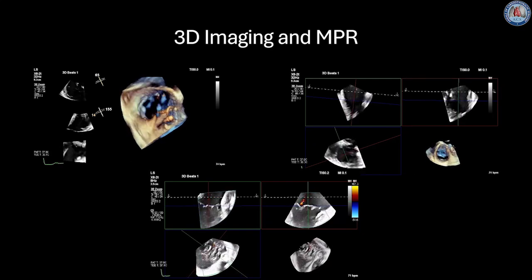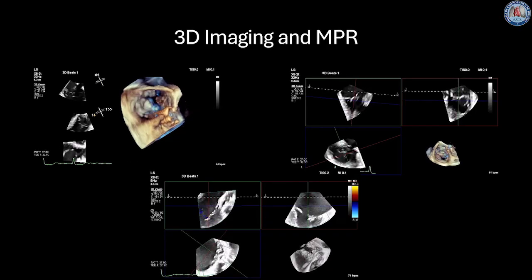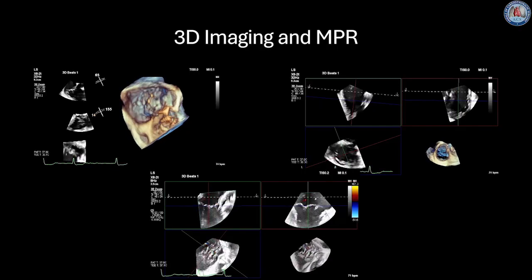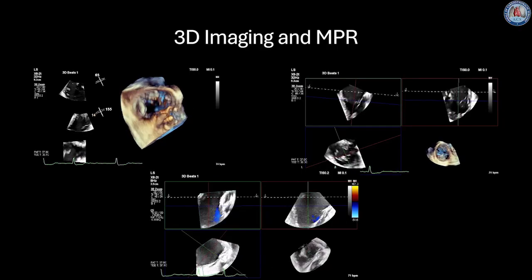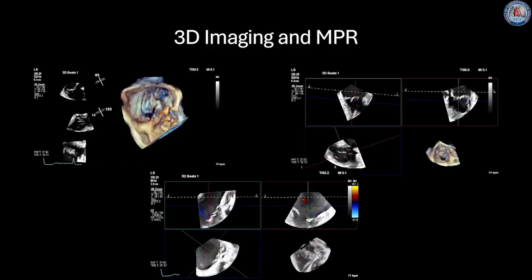In this plane orientation, the tricuspid valve leaflets were well visualized with good overall image resolution and clarity. With color Doppler applied, the origin of the tricuspid regurgitation jet was clearly identified near the PS coaptation plane, with continued excellent visualization of the grasping view.